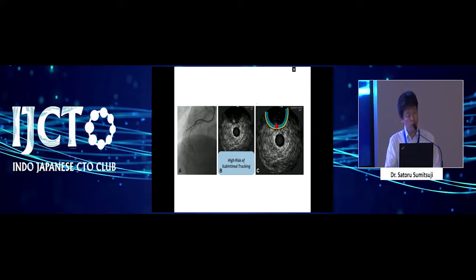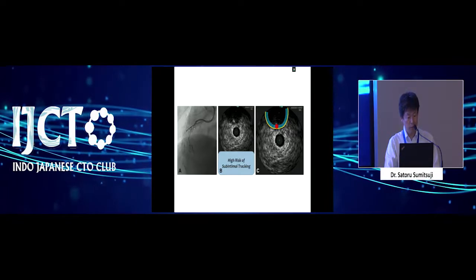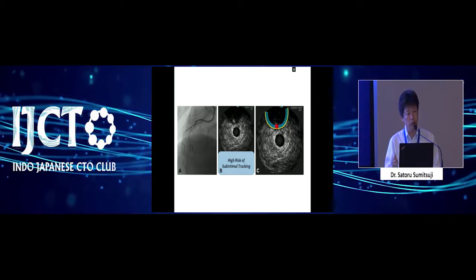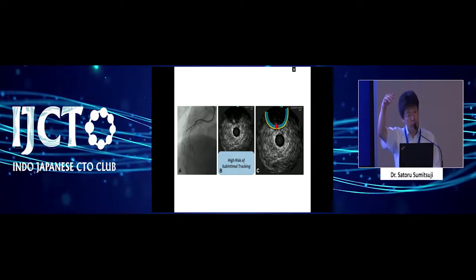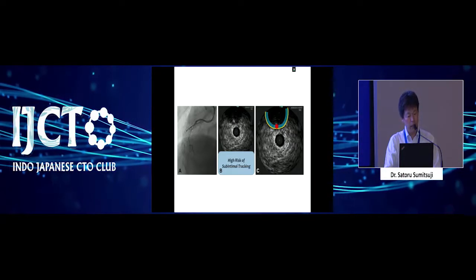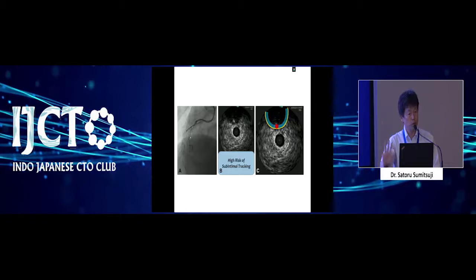Okay, so of course this is not 100% correct. Sometimes the carina side, media is much thinner. So even if it looks like this, disagreement sometimes happens. So I advance a little bit more with the wire, but I already have the information of a higher possibility of subintimal tracking. And the wire goes out too much, so stop.